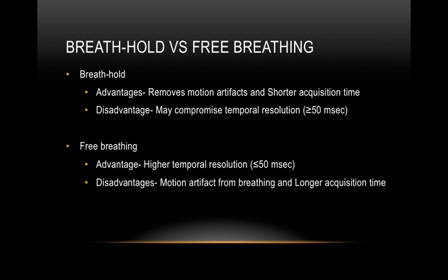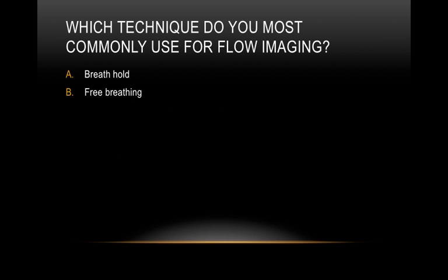You can also perform it with breath hold versus free breathing. Obviously, the advantage with breath hold is there is no motion artifact from breathing, and therefore the overall acquisition time is also shorter because it's performed during a breath hold. However, the temporal resolution is compromised when performing breath hold. As the old saying is, you get nothing for free with MRI. Therefore, because your overall acquisition time is shorter, your temporal resolution is compromised. So with the free breathing, you may have artifact from the motion, however, you do have a higher temporal resolution.